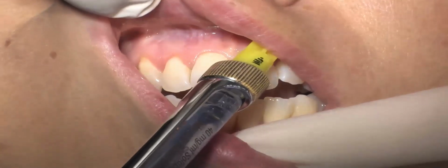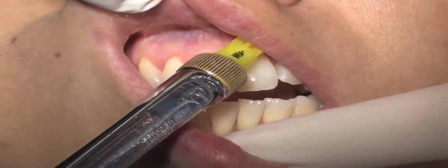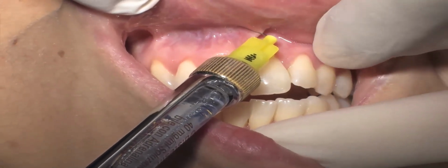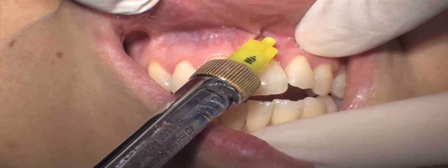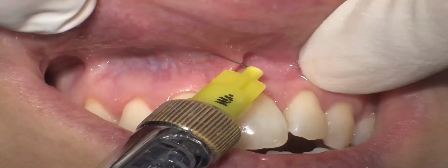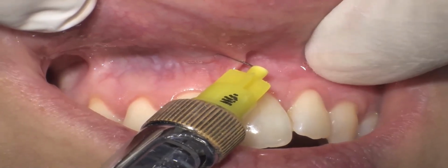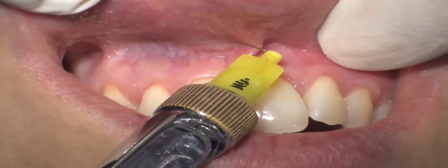I turn the needle towards the area, without making any perforation.